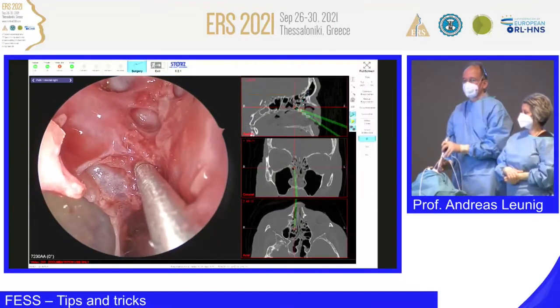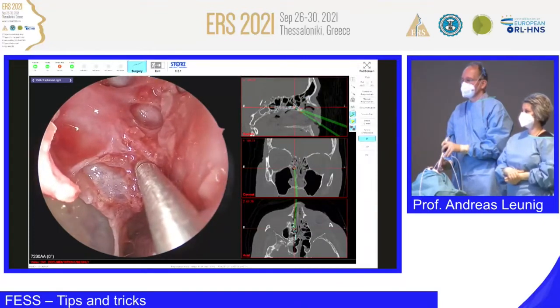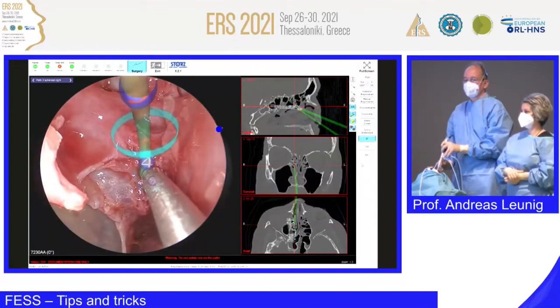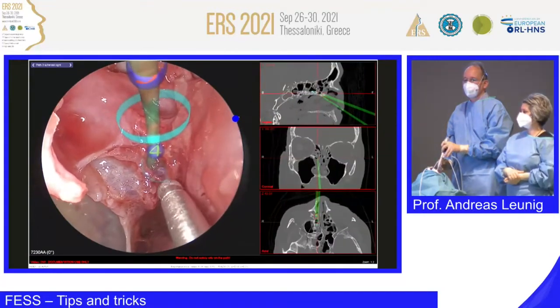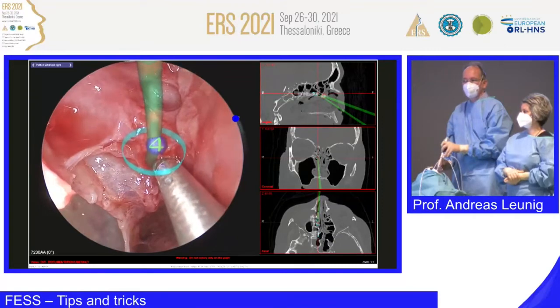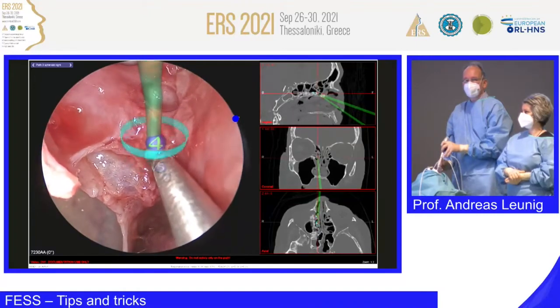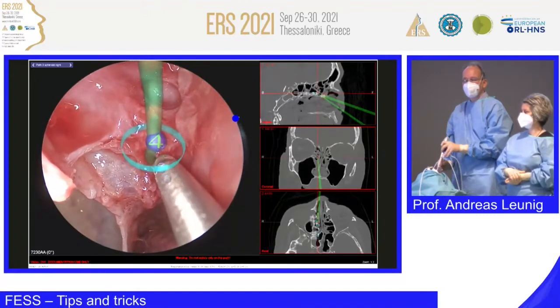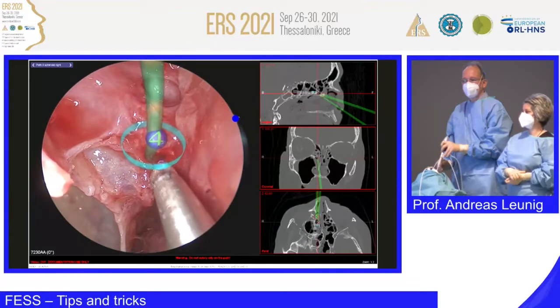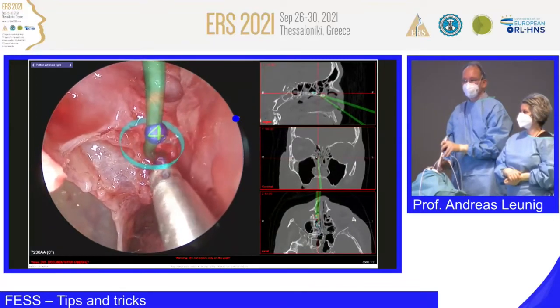Now we were drawing in the pathway into the sphenoid sinus, and as you can see here, this should be the right direction into the sphenoid sinus. First posterior ethmoid and then sphenoid sinus. So what is a reliable landmark to find the sphenoid sinus without having navigation?